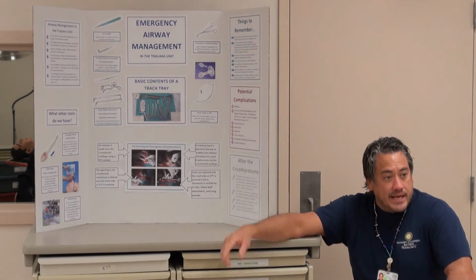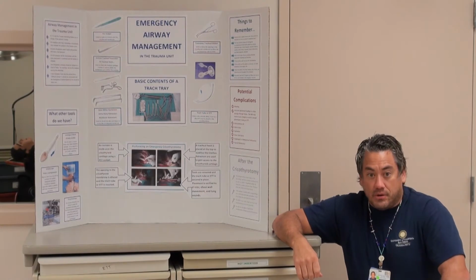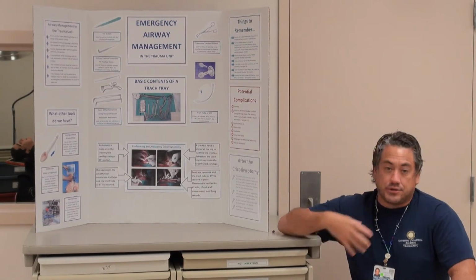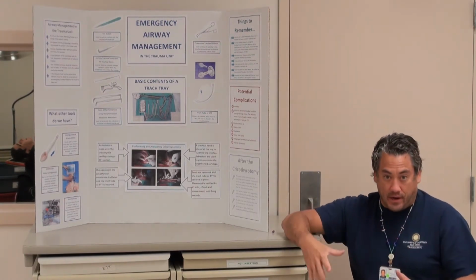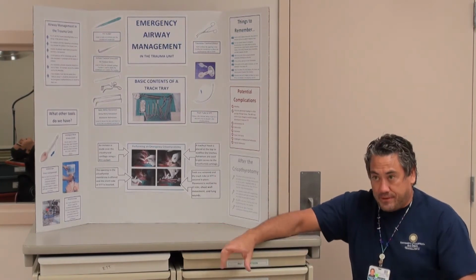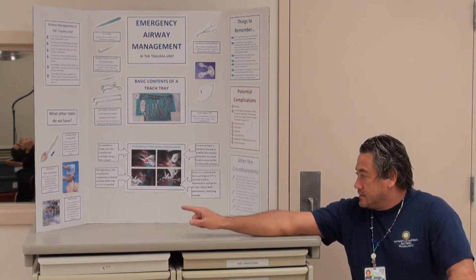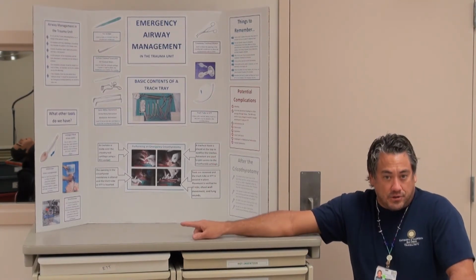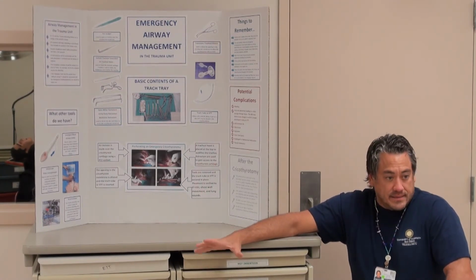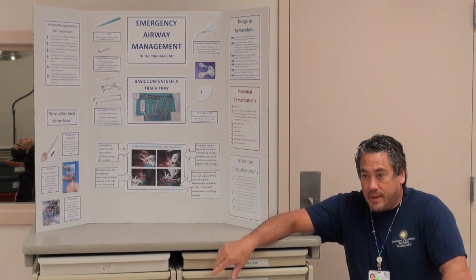It's also up to the attending if they're having trouble getting an airway. Maybe you have an LMA in there and you're ventilating the patient pretty well, but it's a semi-bad burn patient, or they have a big hematoma forming, and the airway looks sketchy to begin with. But they're doing a good job ventilating and oxygenating the patient. They may say, call the attending to see if we can get the bronch card in here. If they feel they have time and that's the safest thing to do, they'll call the bronch team and try to intubate over a bronch.